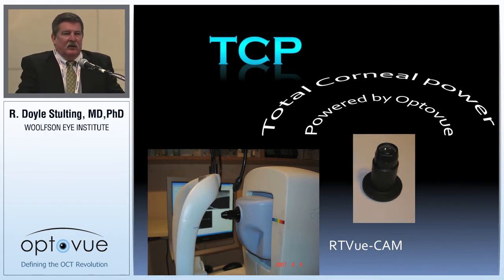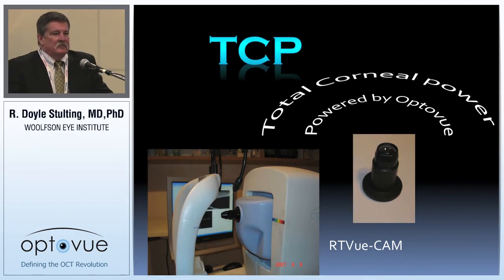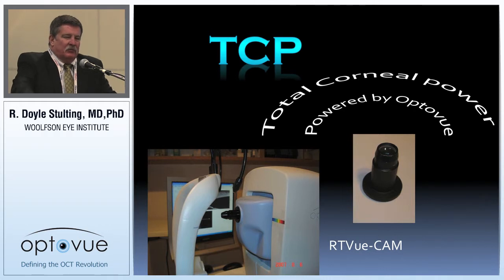I've been working with the RTVue for Optovue OCT for quite some time. We initially employed it as part of our corneal collagen cross-linking studies. We noticed how accurate it was in measuring epithelial thickness.